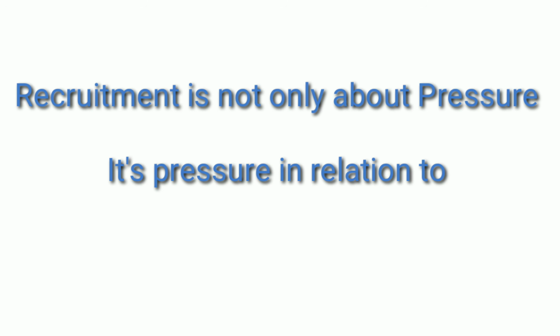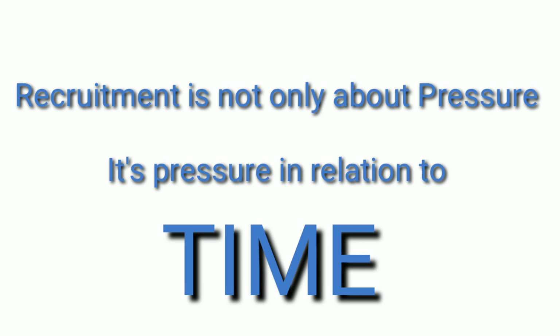So recruitment is not only about pressure, it's pressure in relation to time, right? That's why recruitment maneuvers are done with pressure over time, because within the air spaces, the alveoli have different time constants. Some alveoli may not open even with prolonged pressure over time.